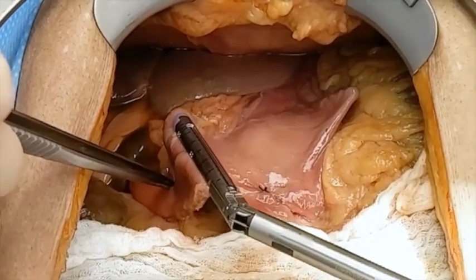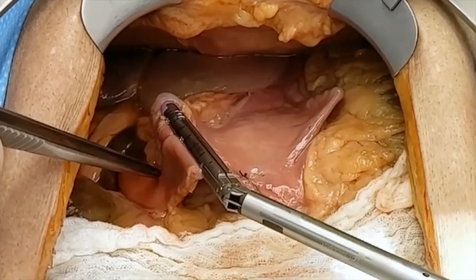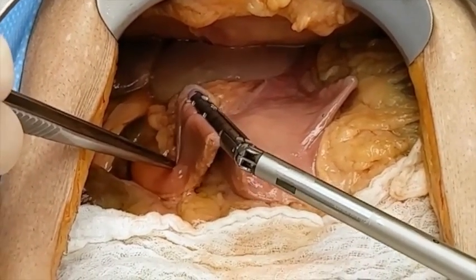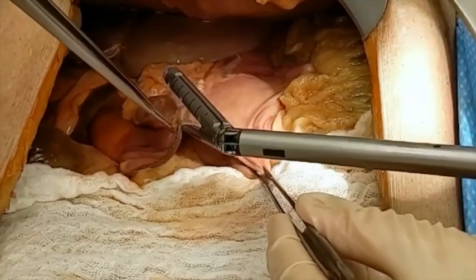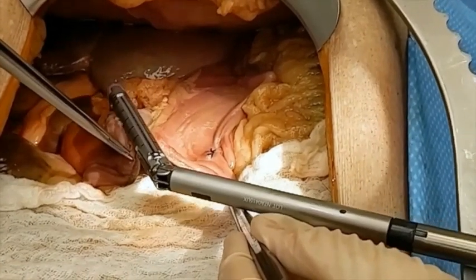Prior to division of the stomach, the surgeon should ensure that the proximal duodenum is not excessively scarred so as to prevent safe duodenal transection. After mobilization of the gastrocolic ligament off the greater curve of the stomach, the lesser sac is entered and the site of gastric resection is identified. This is typically located at the incisura angularis.